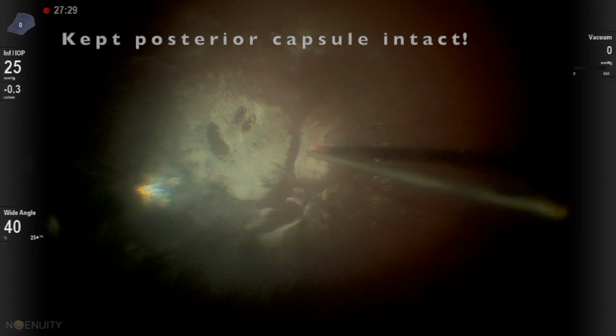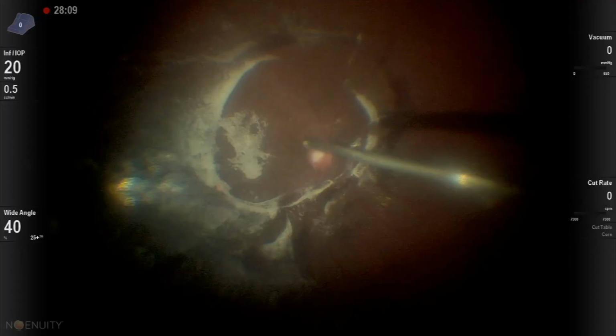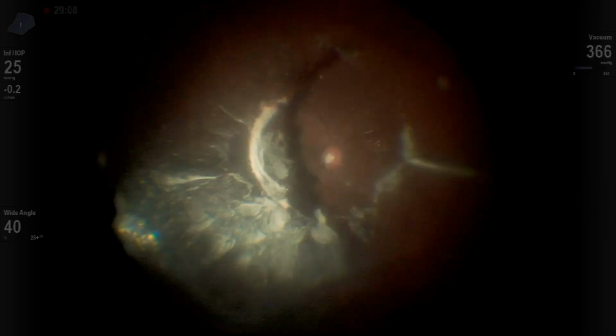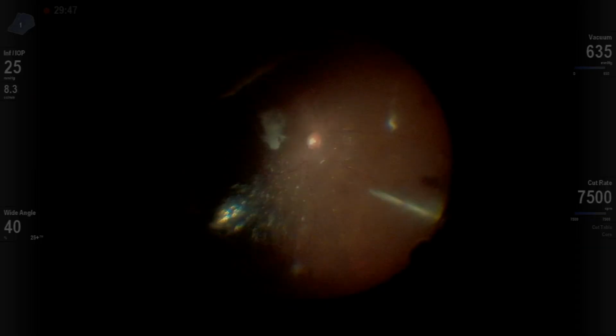Attention is now given to the posterior segment for pars plana vitrectomy. This starts by posterior hyaloid separation, followed by removal of the vitreous at 360 degrees. Internal surgery reveals retinal whitening as well as retinal holes from trauma.